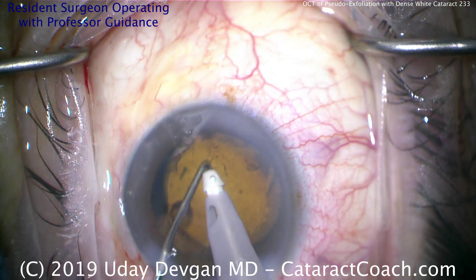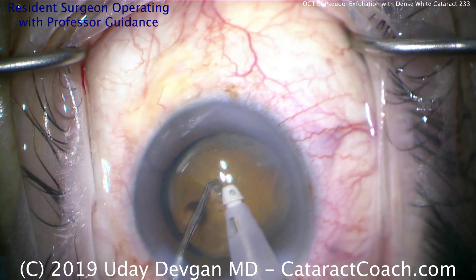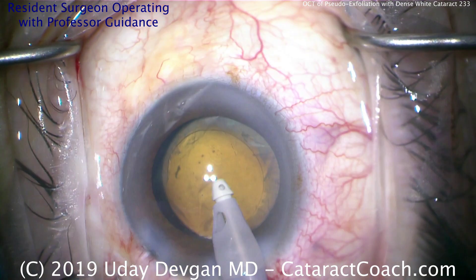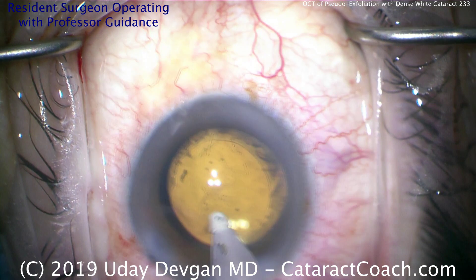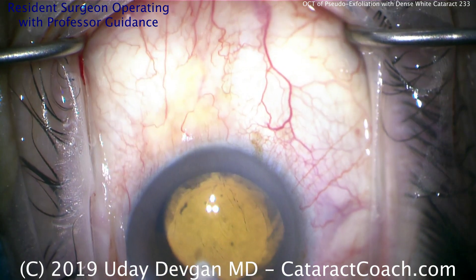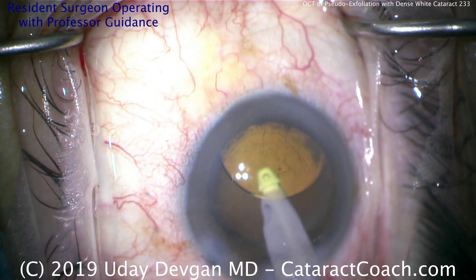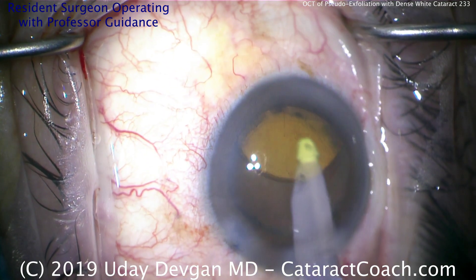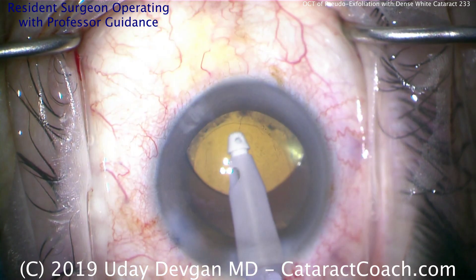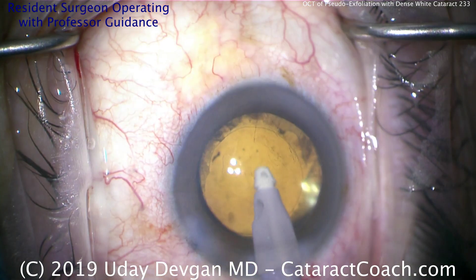Now let's center up that optic. Very important — both haptics and the optic must be completely within the capsule bag. If we have one haptic in the sulcus, the lens will eventually decenter, tilt and cause astigmatism and other high-order aberrations. That thick haptic can scrape the back of the iris, which can cause depigmentation, transillumination defects, glaucoma, microhyphema, and chronic inflammation. So make sure the entire lens — the optic and both haptics — are completely in the capsule bag. Let's remove the viscoelastic and center up the lens — looking really quite nice.